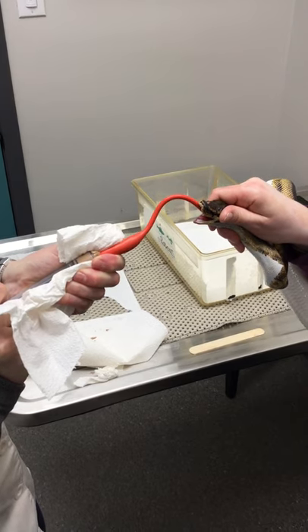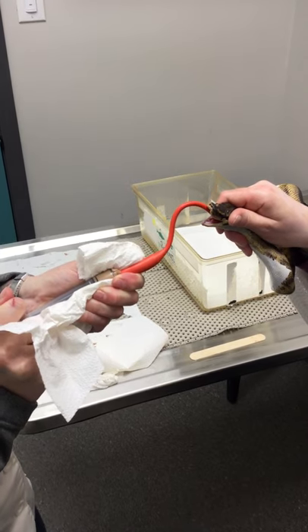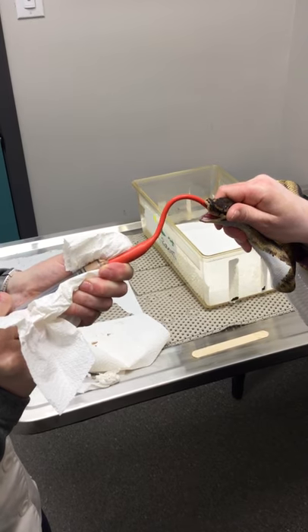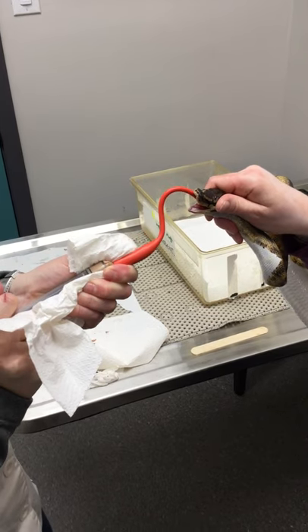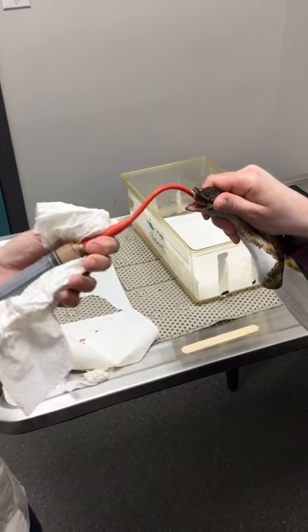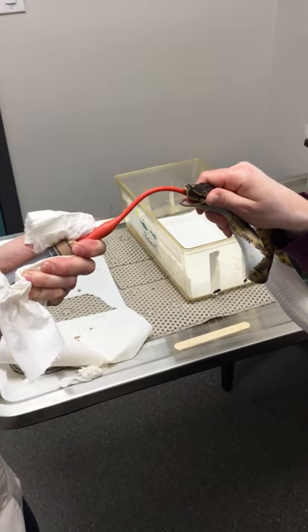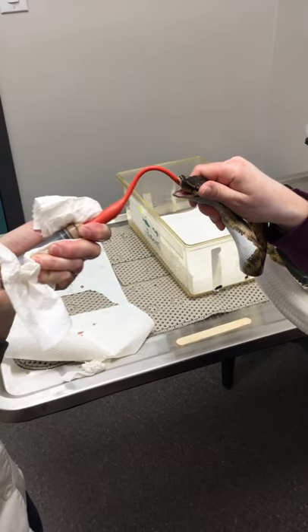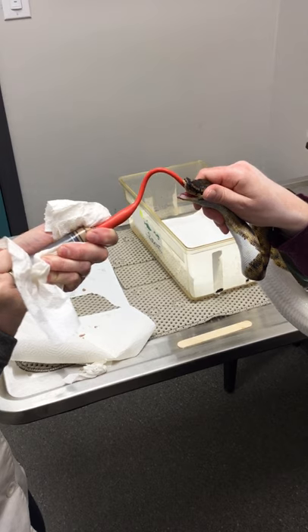This is not limited by the snake — it's only limited by the size of the tube and how fast it comes out the other end. My arms are shaking; it takes so much force to push it through the tube.